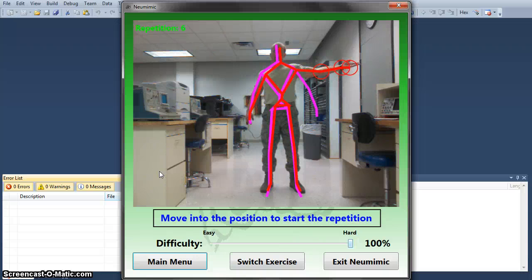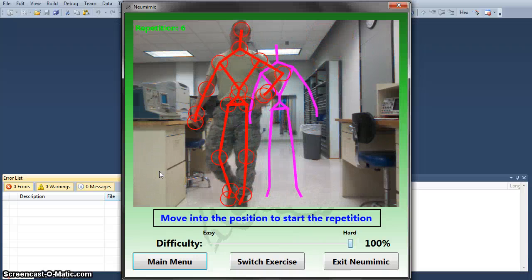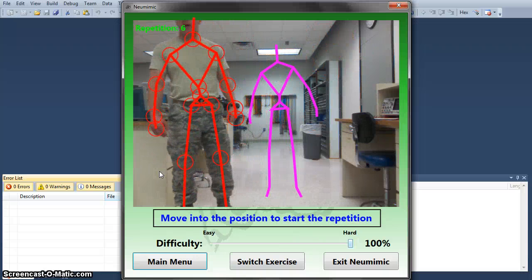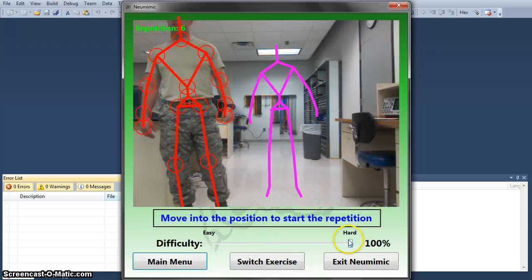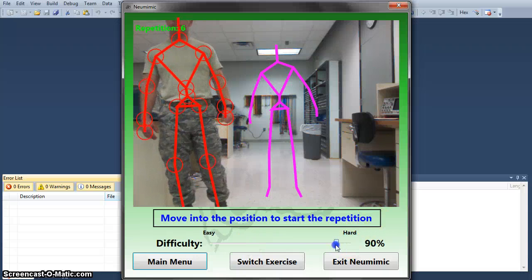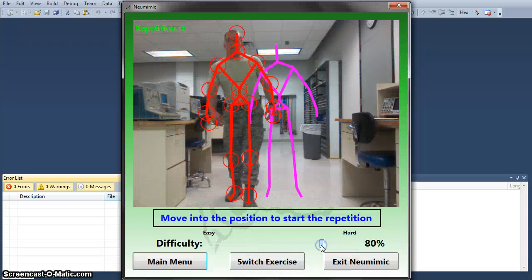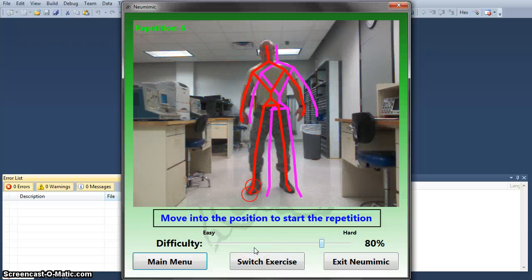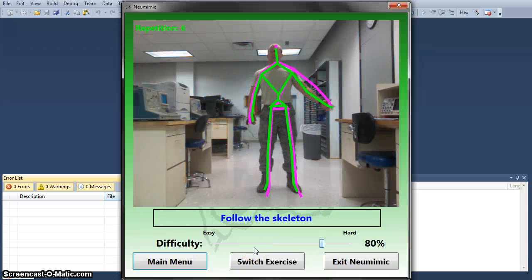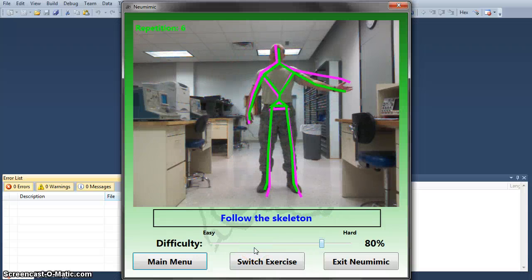That was just a complete range of motion. Now I set it to 80%. I am going to complete my last few reps at 80% difficulty.